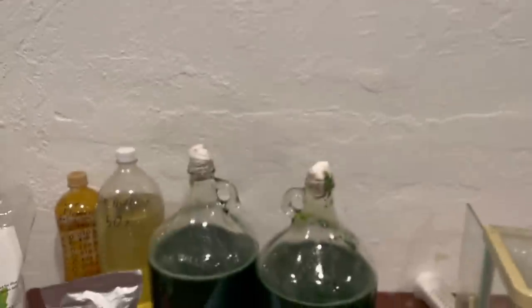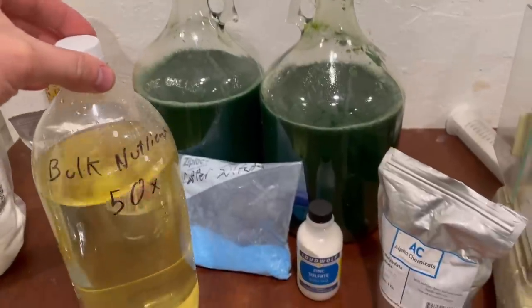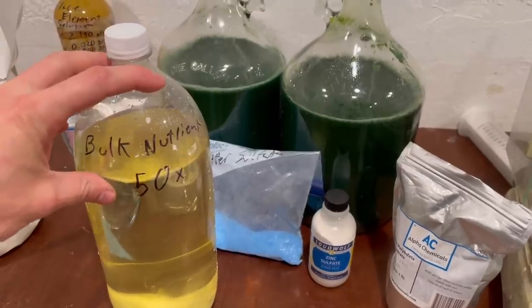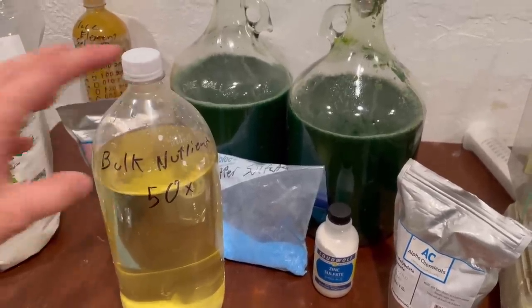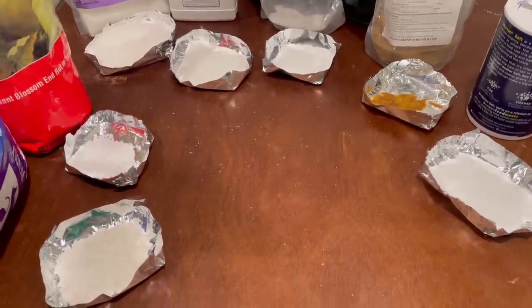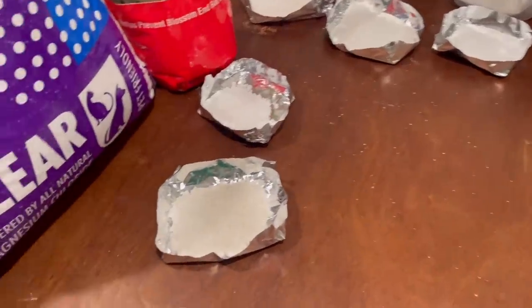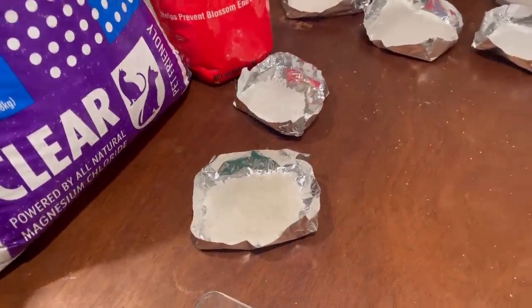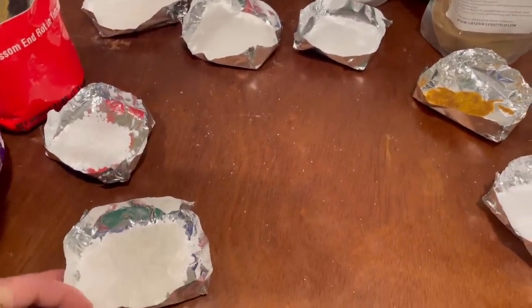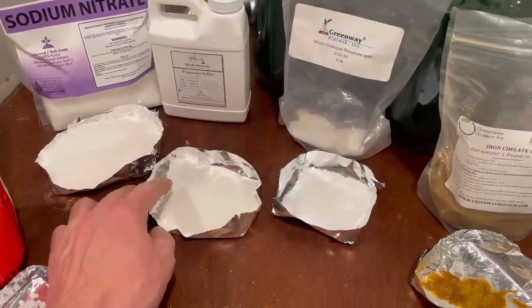Now let's work on the bulk nutrient, which I'll probably split into two parts — the A/B thing you've probably seen if you've done hydroponic stuff. Here are the ingredients for the bulk solutions weighed out. I've made a few changes from last time. First, I'm using just magnesium chloride instead of magnesium sulfate.